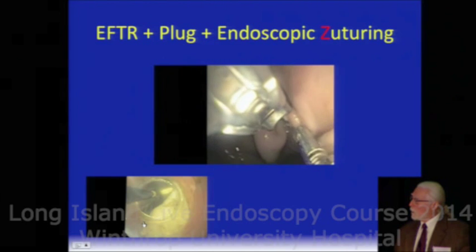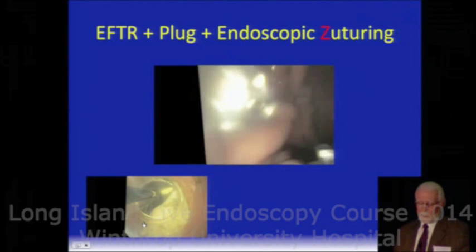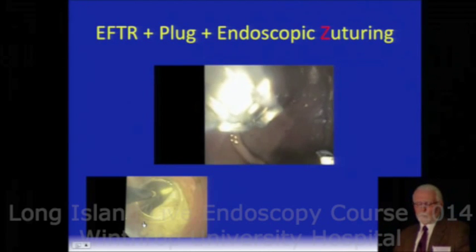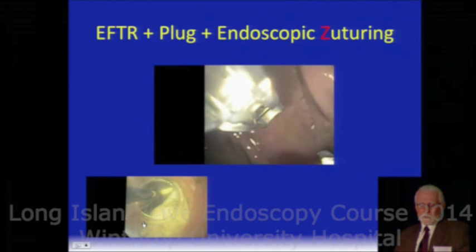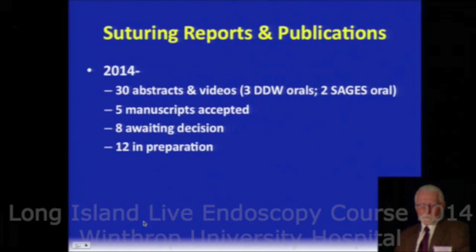The top part of the plug, which is on the lumen side, is impermeable, so it should overlap the hole and prevent things from seeping through while the rest of the plug does its bio thing. So here you can see it slowly closing down with a series of sutures over it.